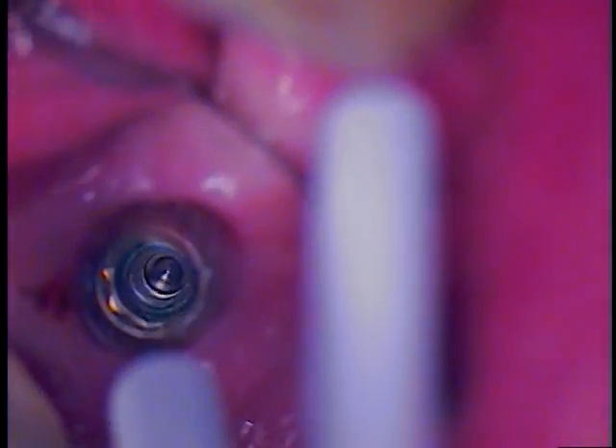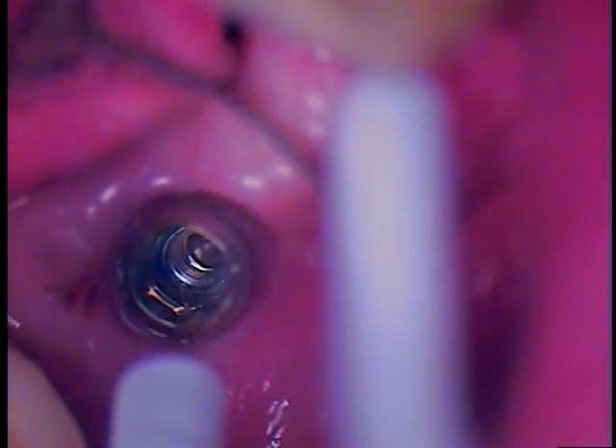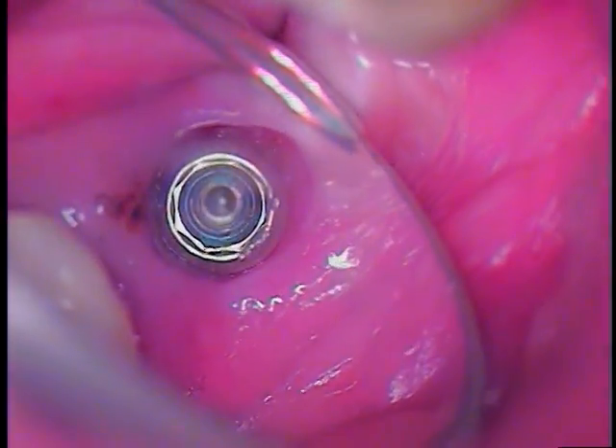I'll take the next size up — it's the next size. I'll zoom in. Second molars are not that easy. It's a larger Christmas tree — red coat. It looks good here. We've got a serial number we can pick up here. If I just dry the mirror, we can actually pick up the serial number.